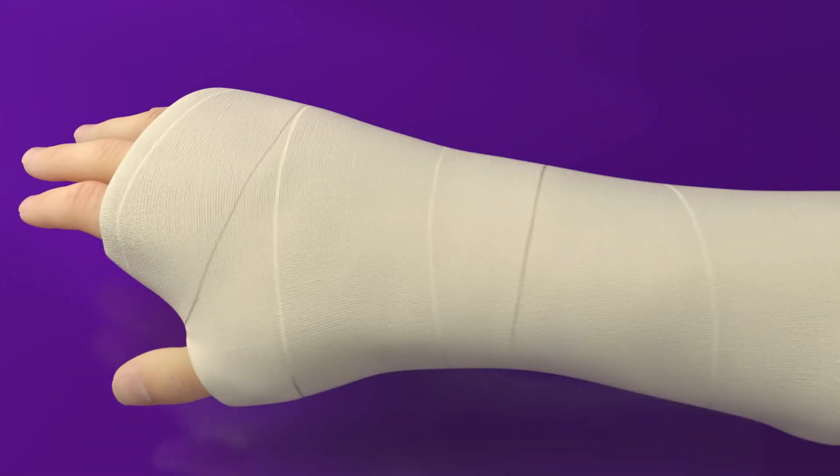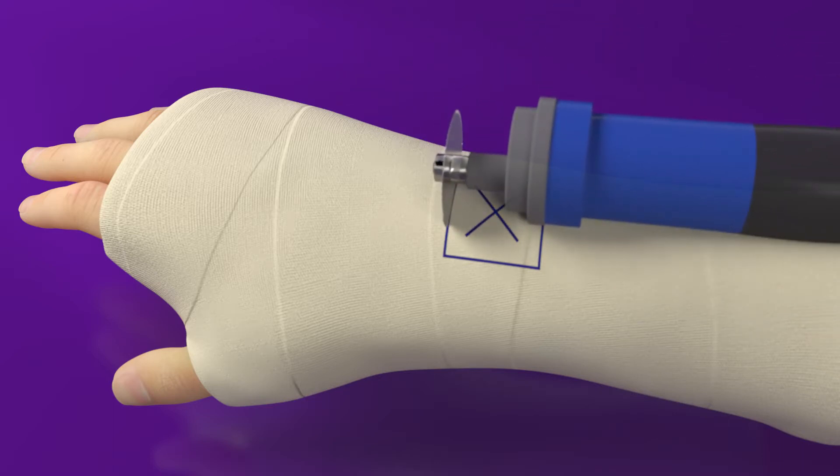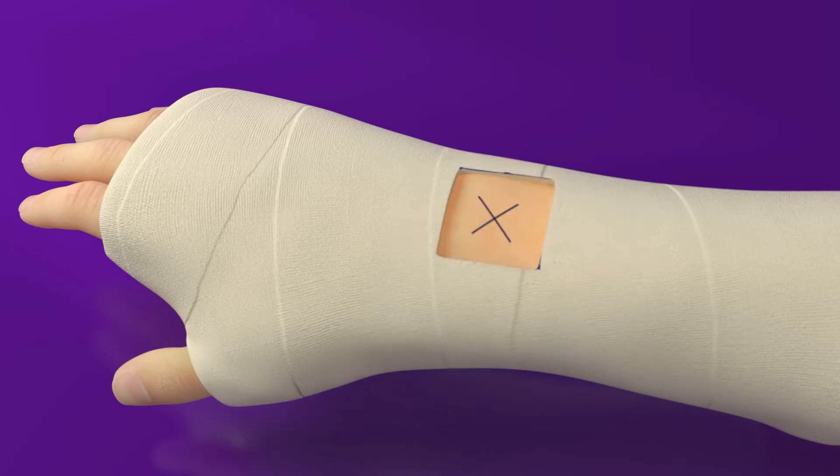Now that you're familiar with the components, it's time to begin. First, locate the fracture site by using an x-ray and mark the treatment area on the CAST with an X. Using a standard CAST saw, cut a window out of the CAST. Remove the newly created window along with any excess padding. Cut the stockinette with scissors.